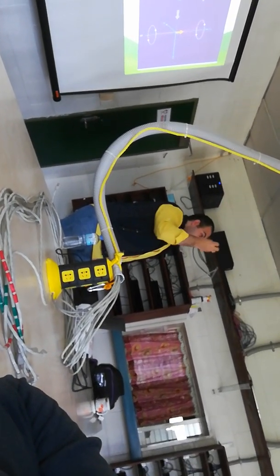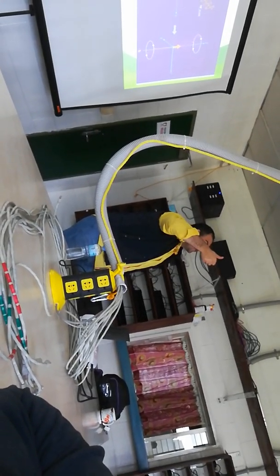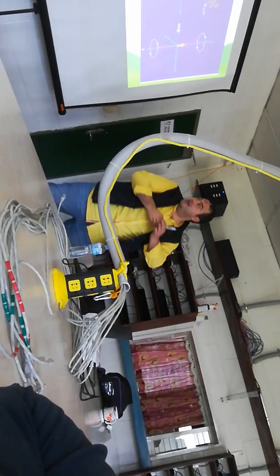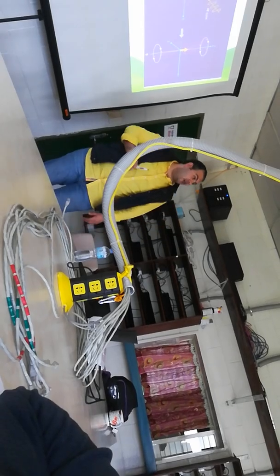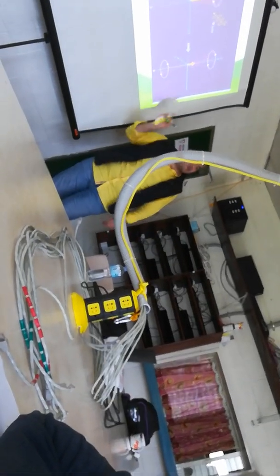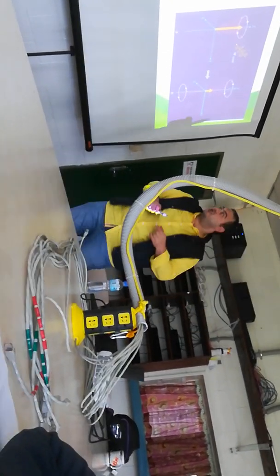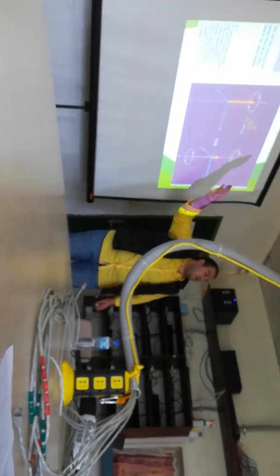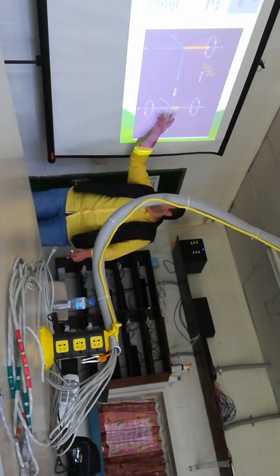But after acquiring the energy, they will be converted from the relaxation state to the excited state, from the Z direction to the Y direction. So the net magnetization here will be transversal magnetization, and the protons here will be converted from relaxation state to an excited state.